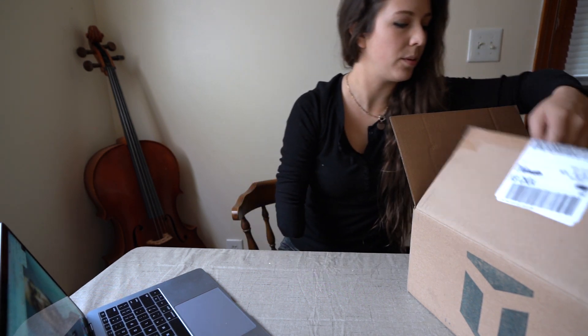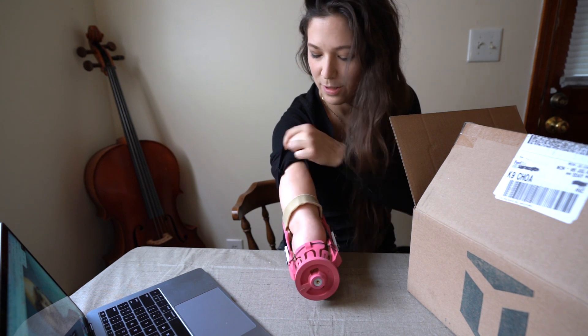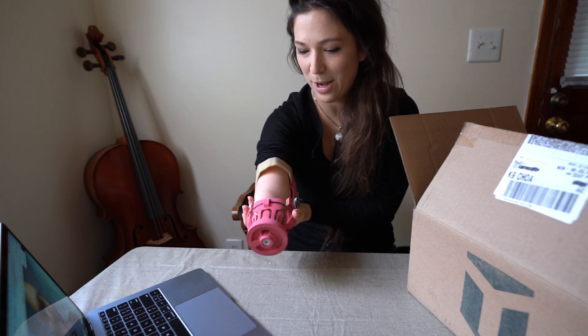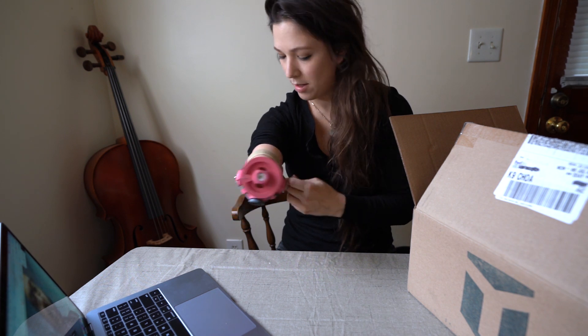All right, so why don't we go ahead and start with the red socket. This is very different than the plaster of Paris casting that I grew up using for myoprosthetic arms. All three of these things have been based off of the scan that you sent in with the iPad.